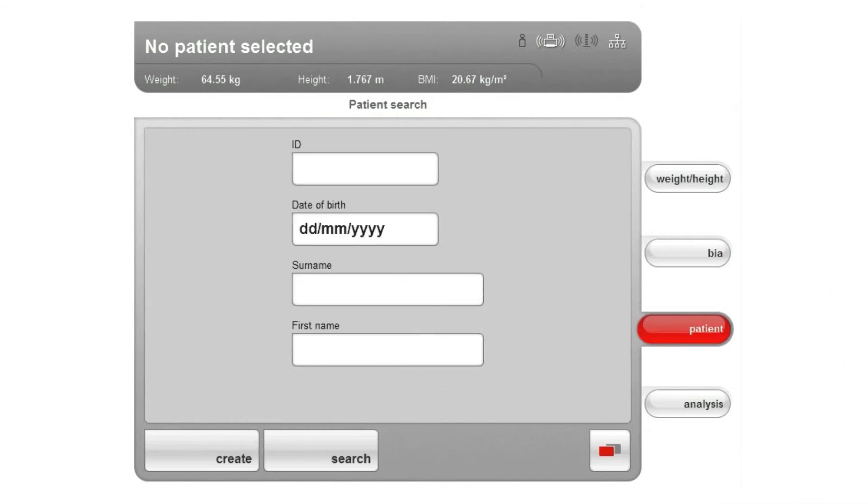In the next step, you can assign the measurement data to an existing patient file in the patient tab or create a new patient file. You can then view the evaluation of the measurement results in the PC software.